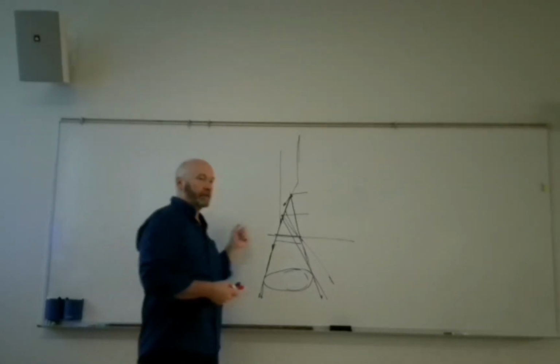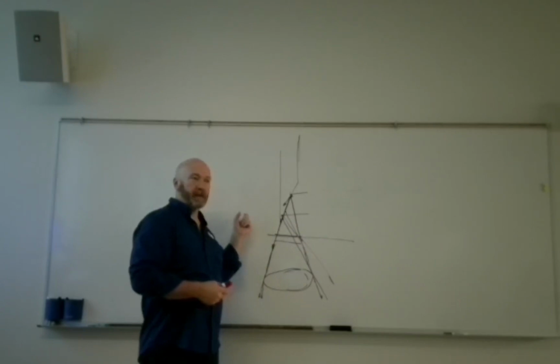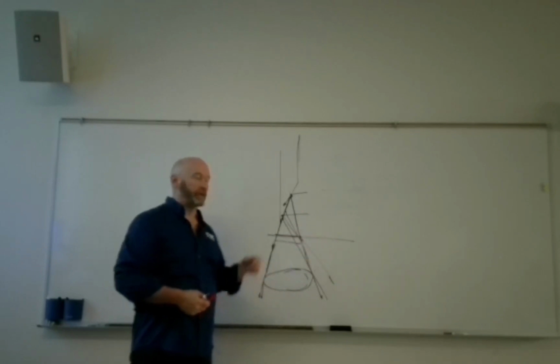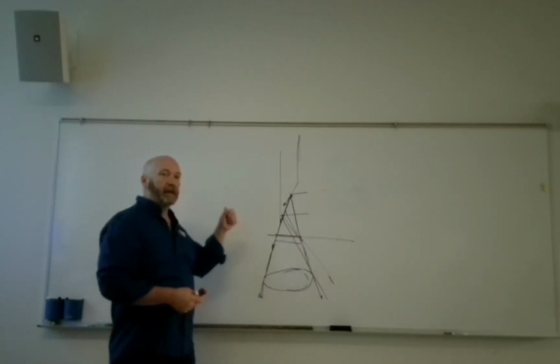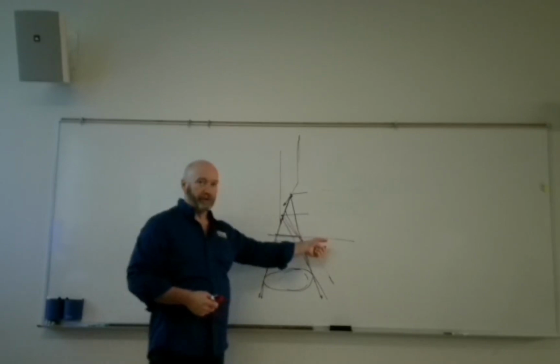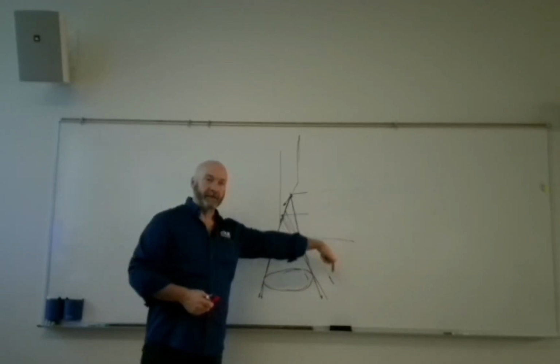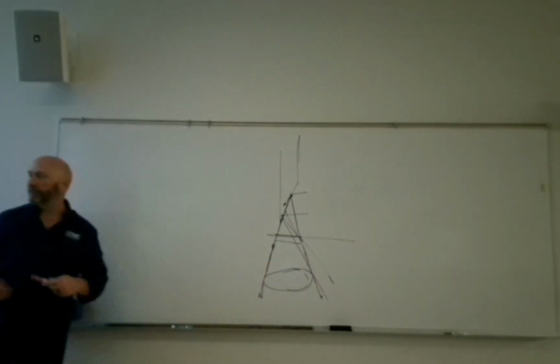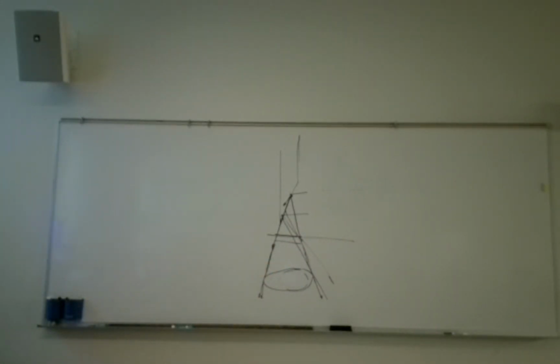So where is the penumbra greatest? The cathode end of the X-ray tube or the anode end of the X-ray tube? Cathode end of the X-ray tube. We have less sharpness on the cathode end of the X-ray tube. Sharper on the anode end, less intensity. Unsharpness on the cathode end of the X-ray tube, more intensity. So the anode heel effect has two different things. One is not just the difference in density or difference in exposure, but also we have a greater amount of blur on the cathode end as well.